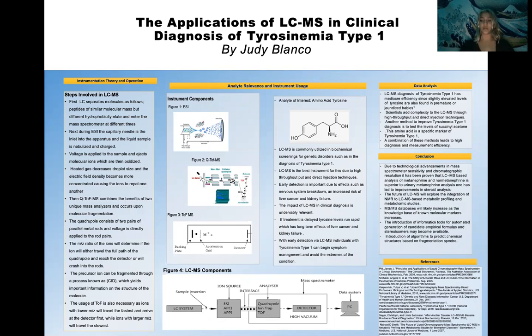The steps are as follows: extraction of desired proteins, removal of contaminants, digestion of proteins into peptides, separation into a homogeneous peptide mixture, and identification via MS. In order to identify the protein, MSMS is used, and identification occurs via comparison to a database of previously discovered peptides. LC is first used to separate molecules as follows.